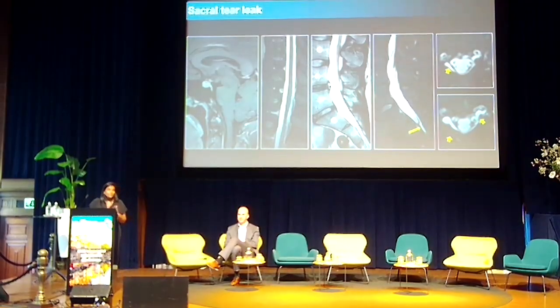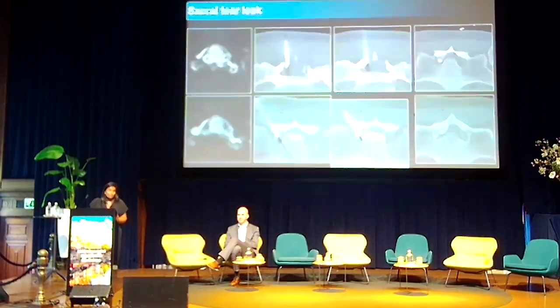And like Jürgen said, we really love to patch these leaks because I think accessing these leaks surgically can be more challenging, and they get really great results.